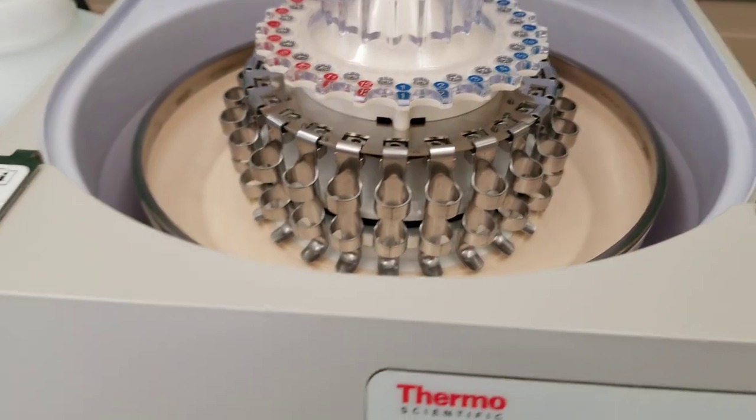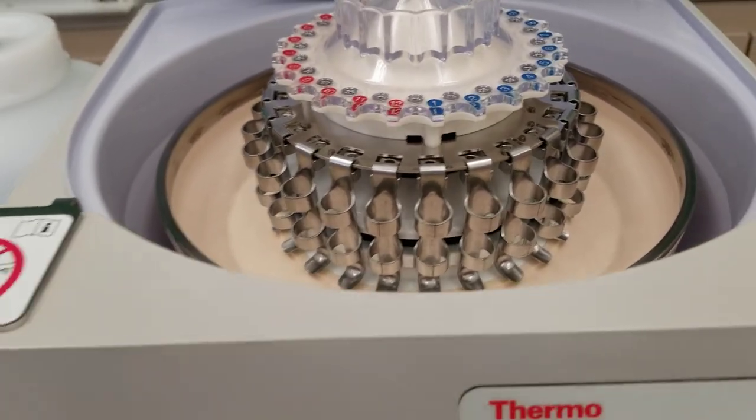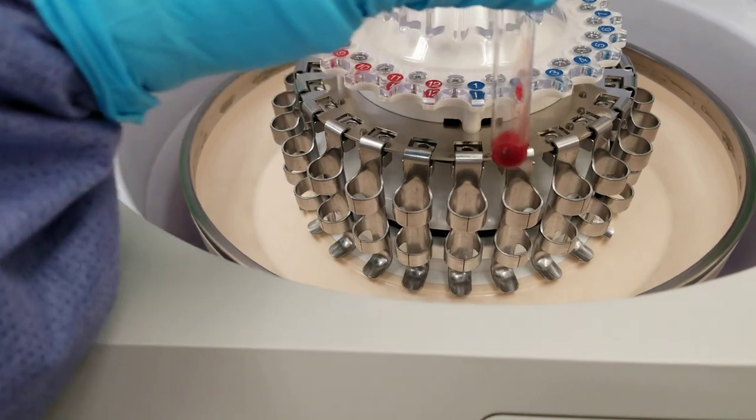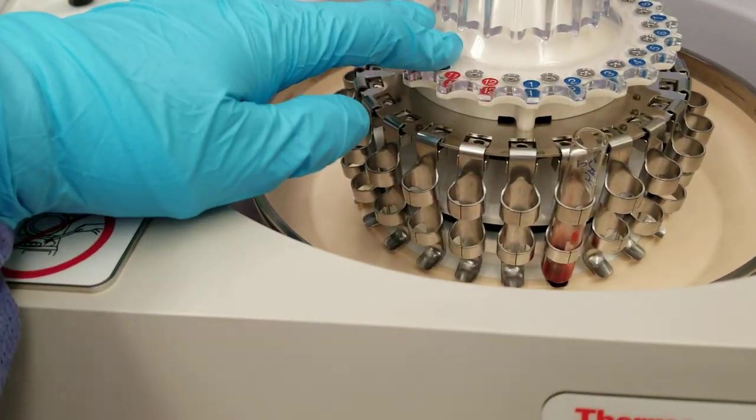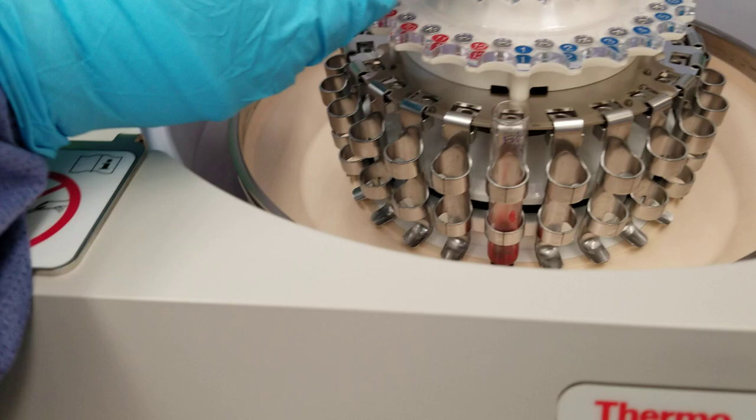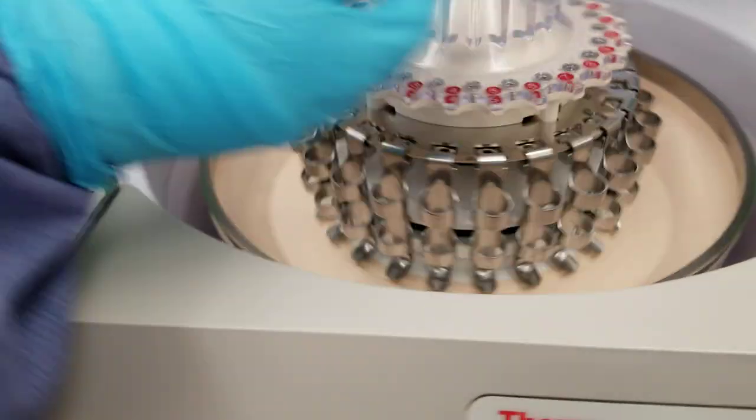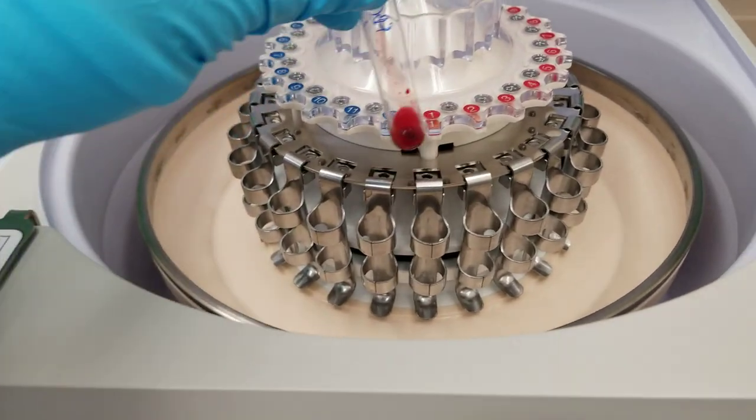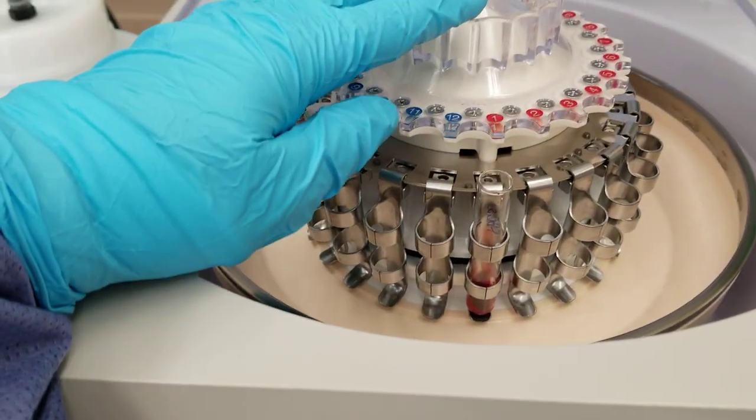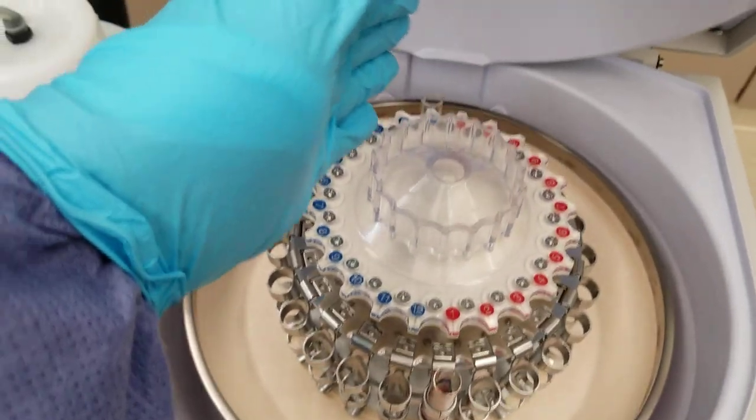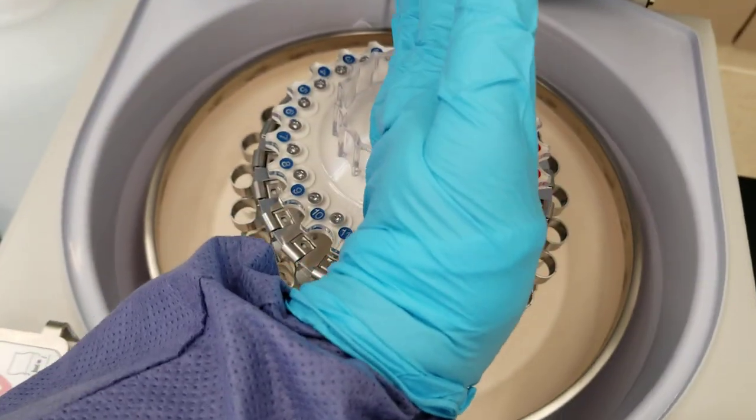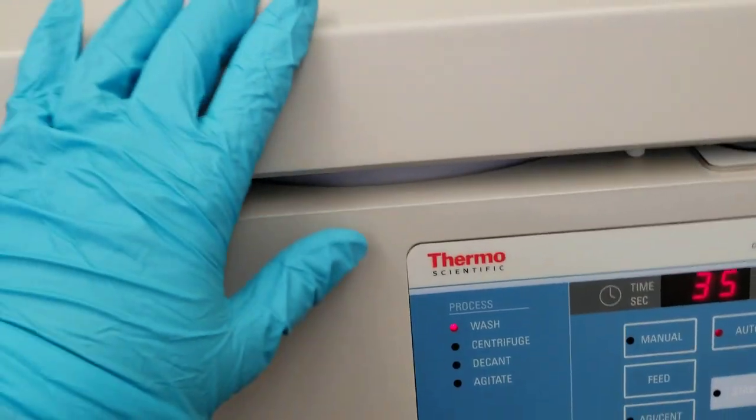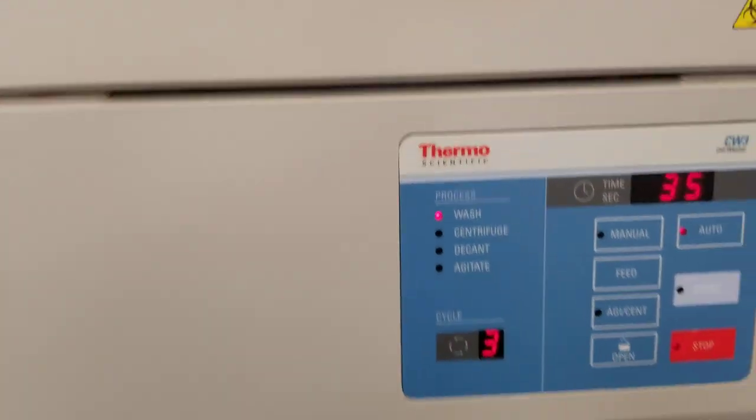So let's actually run a cycle. Okay, we have some red blood cell tubes. Okay, I'm putting it on one in the blue and I'm going to put it on one in the red. That ensures that I have it across the rotor from each other, across each other through the rotor. Okay, we're going to close it up. We're not slamming it. You're just going to press it gently close.